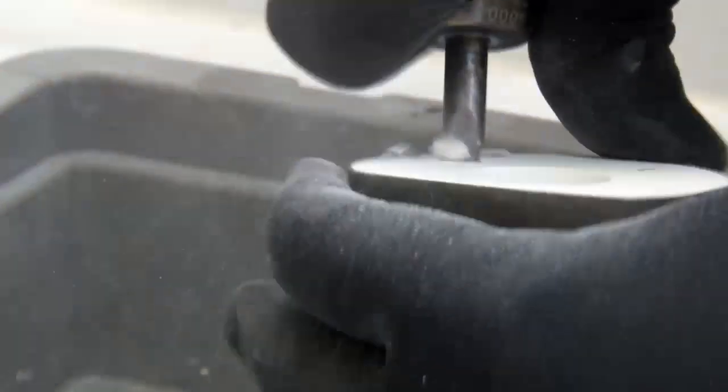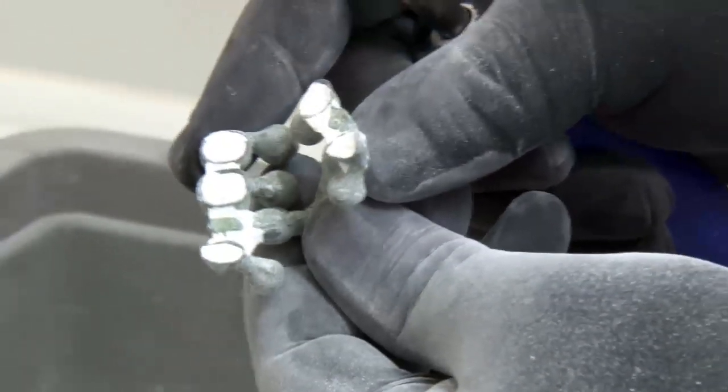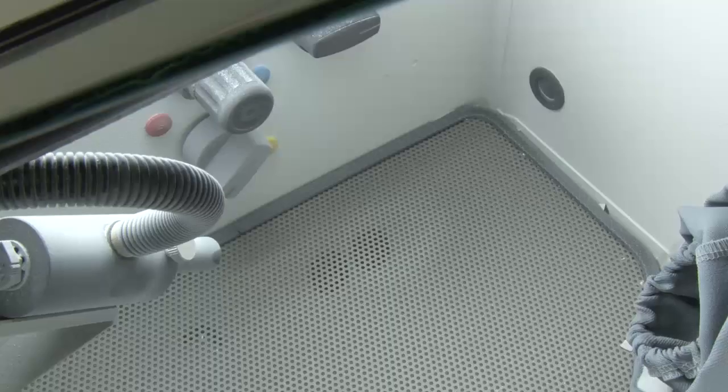The next step is to divest the muffle. First, the ring is removed with a pneumatic chisel, and then as large pieces as possible are removed at once to expose the restorations. This is only possible to a certain extent. Invest material in and between the restorations cannot be removed with a pneumatic chisel.